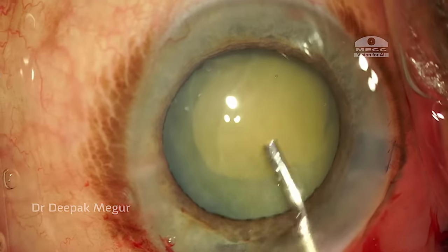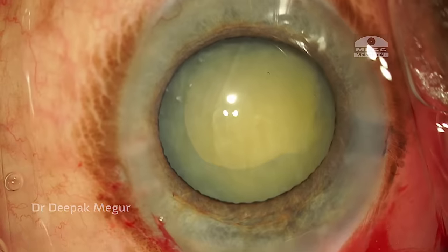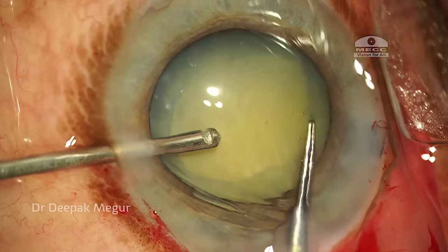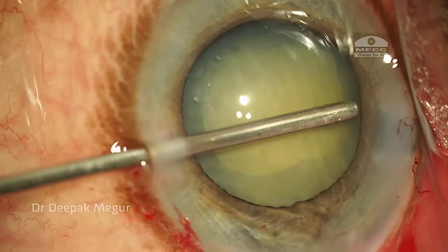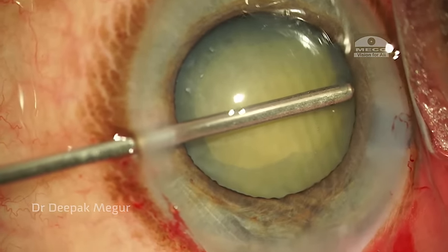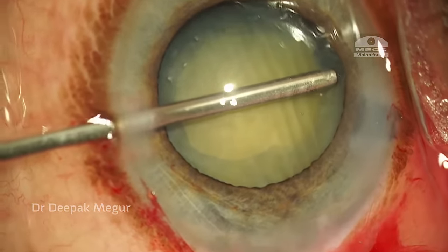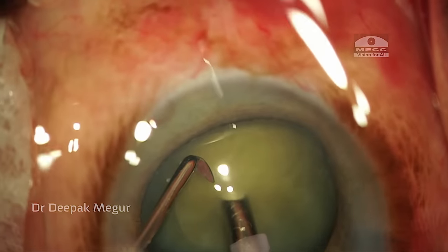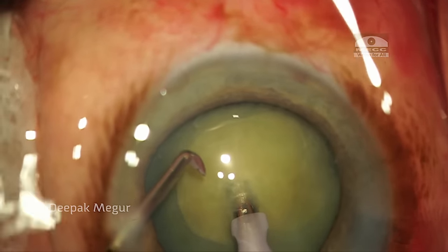I am checking for the mobility of the nucleus — whether it is freely mobile without any movement of the bag. There is a small flap in the area of zonular adhesions which is bothering me. I try to tear it using a capsular forceps; it doesn't work. I go back to my cutter, but that also doesn't give me the expected result. So, leaving that aside, I proceed to emulsify the nucleus.